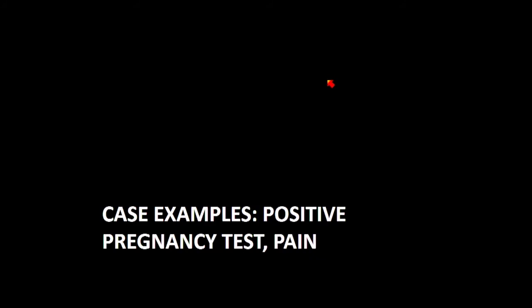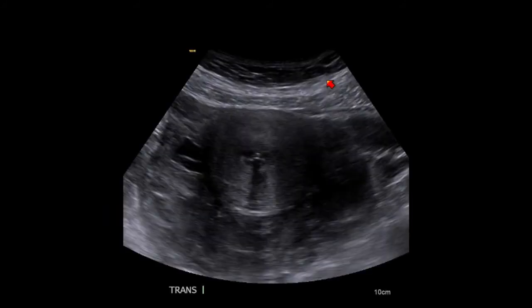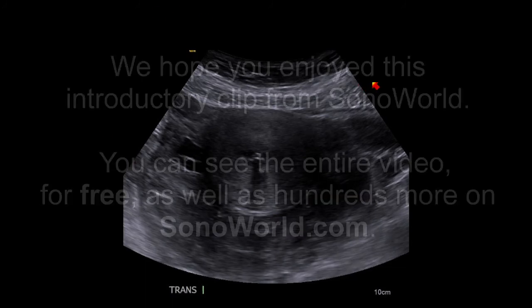I'm going to start out with a case example. Here's a transabdominal ultrasound — positive pregnancy test, pain and bleeding. This is the uterus, this is an IUD, and there's all of this stuff around the outside of the uterus.